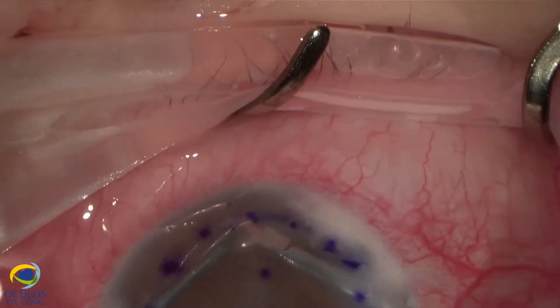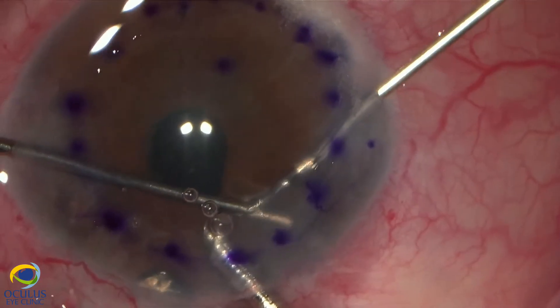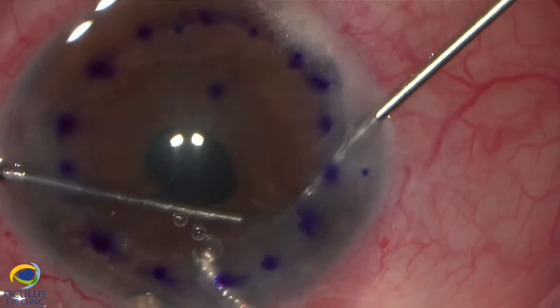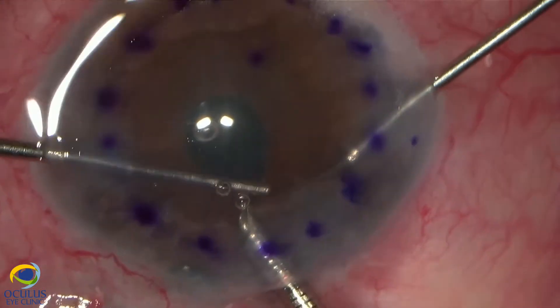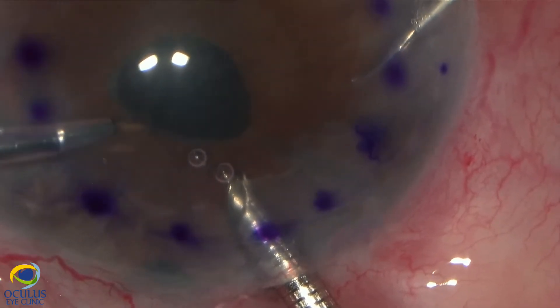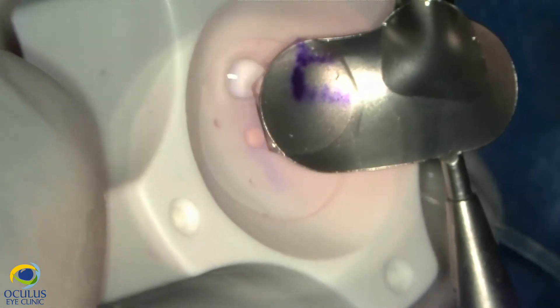We now perform a peripheral iridotomy at six o'clock. This should be done as peripherally as possible to avoid pupillary block after injecting air at the end of surgery. With fine vitreoretinal scissors, we cut the end of the beveled tube, which was too long, coming into contact with the pupil and iris and deforming the pupil.